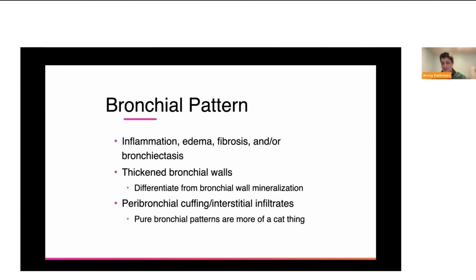And so you will definitely find cases where they have bronchitis, you do the BAL, you do the transtracheal wash, you treat them empirically, and they get better. Because they do have the disease, it's just that there's a certain cutoff where you're not going to see it versus you are going to see it. So just keep that in mind. And that's what makes it a little bit more tricky compared to the conceptual understanding of bronchial disease versus true bronchitis.